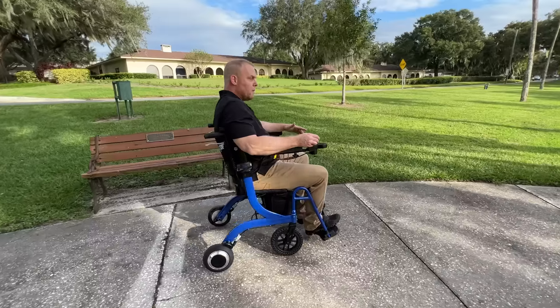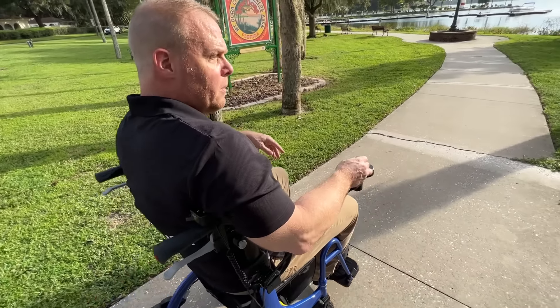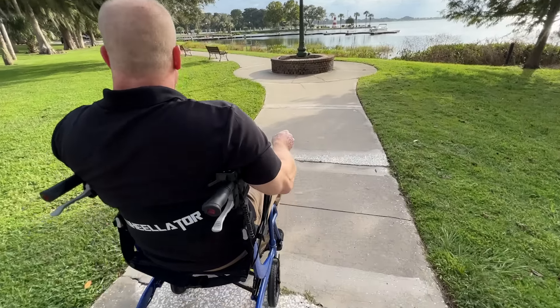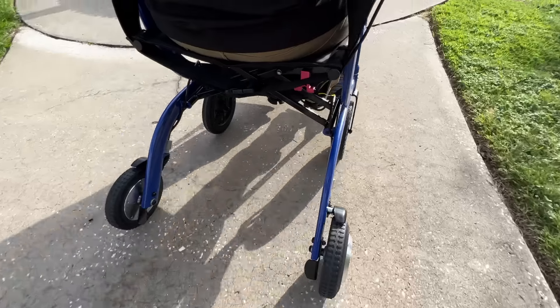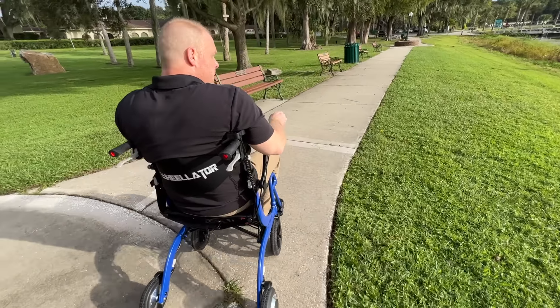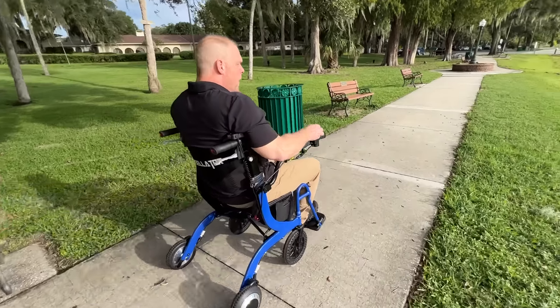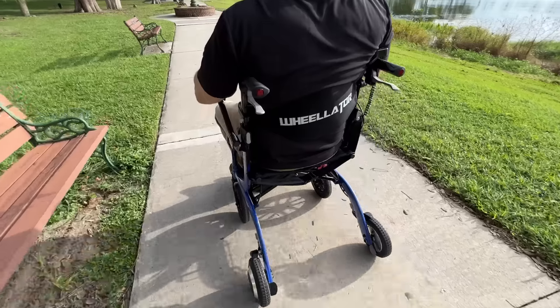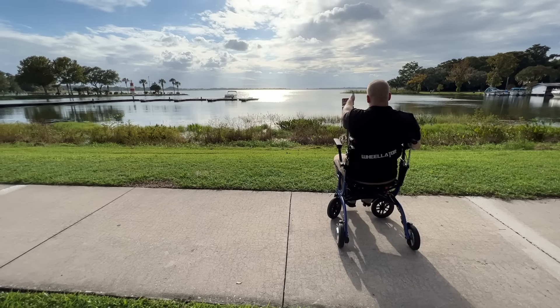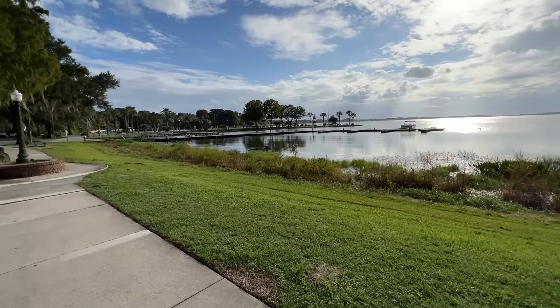I've got a horn. So let's go ahead and get this joystick going and I'm cruising along on the sidewalk here. What a wonderful experience I'm having. I went from walking — even breaking a little bit of a sweat because it's Florida, it's been raining, the sun came out — and right at my fingertips I have just instantly the ability to turn this into a wheelchair. It's actually pretty quick — I can go right around four miles per hour top speed with this thing. So let's go ahead and take a little break here and take a look at the lake. I'm looking at some of the birds out there, sitting and seeing some boats.